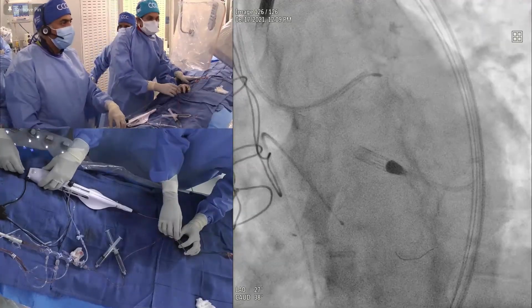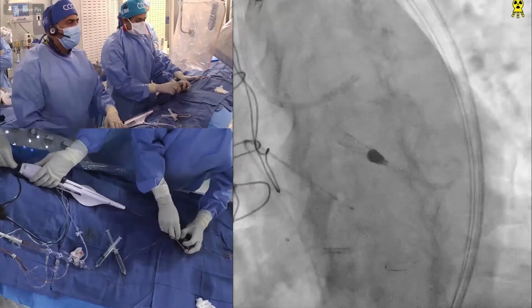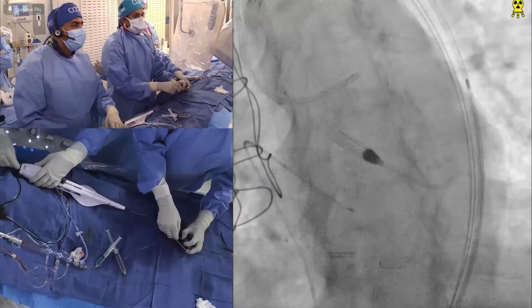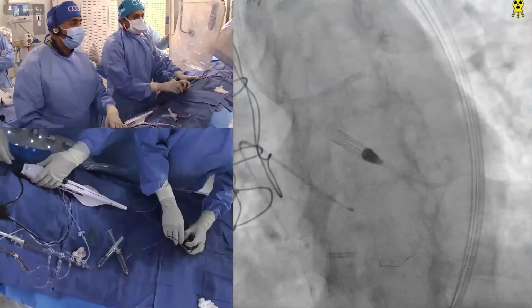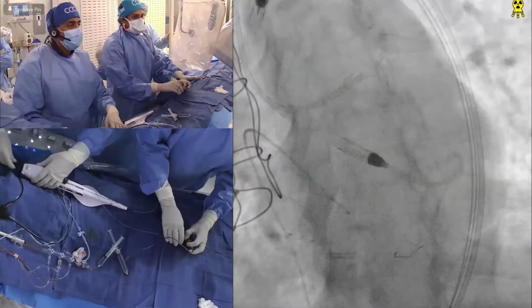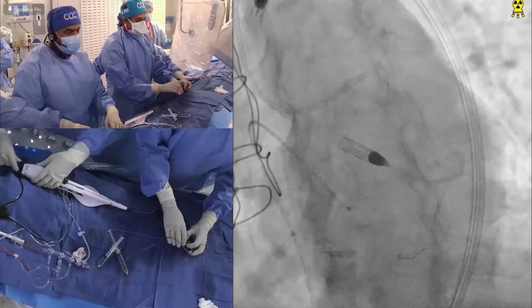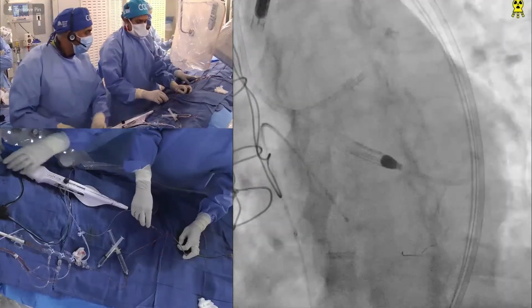Okay, ready? But I will say that this Impella is approved for this kind of protection. So two things. One, complication, and secondly, in a long calcific lesion, it decreases the slow flow. So that is the key. It will decrease the overall chance of slow flow in this very complex case.